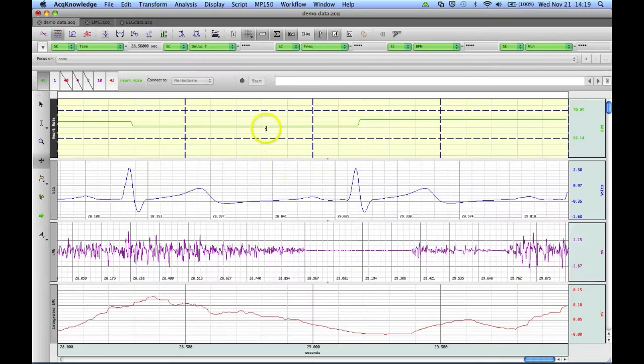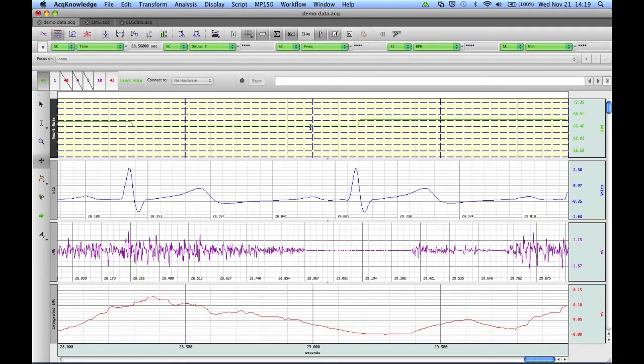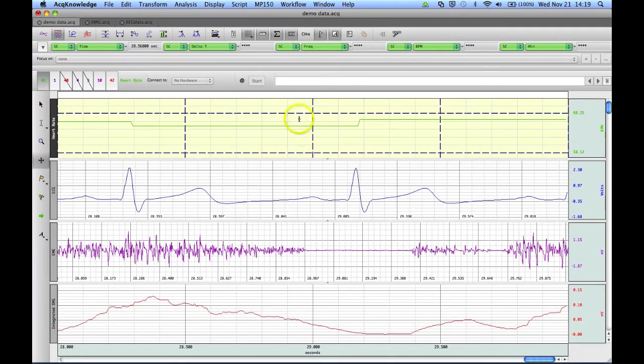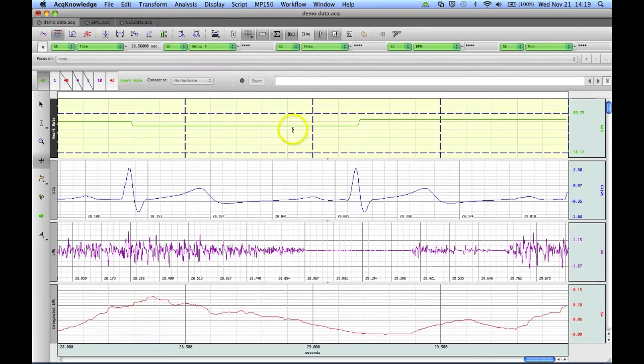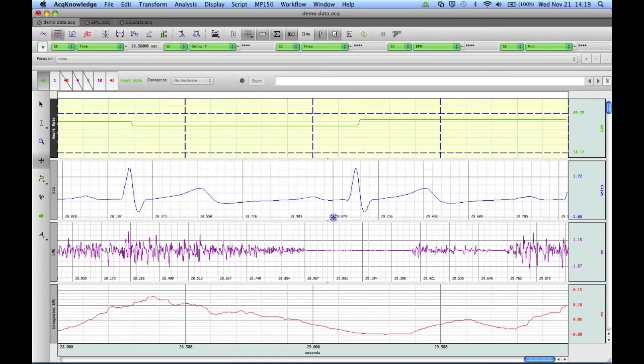If I go to this channel, you'll see I can only do alterations to the vertical as the horizontal is locked. We can tell that by the icon only having the vertical bar showing as opposed to vertical and horizontal.